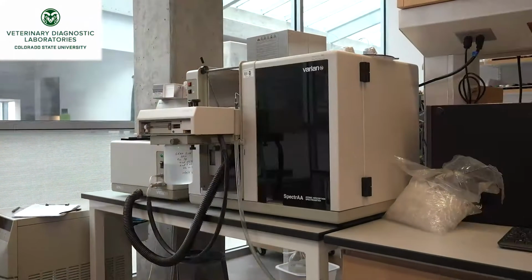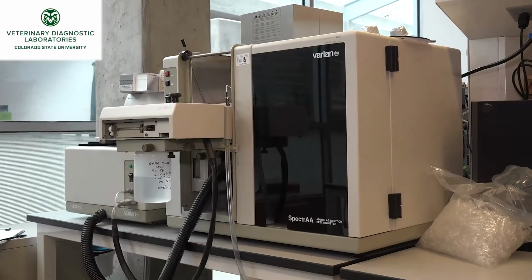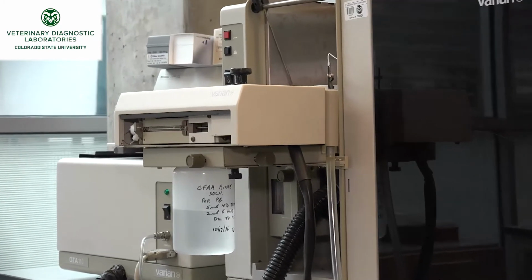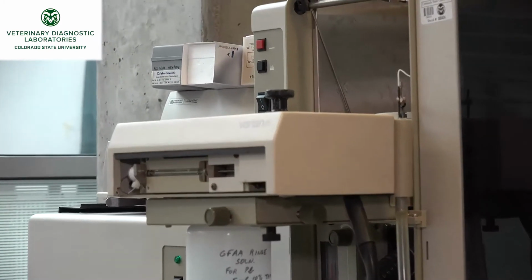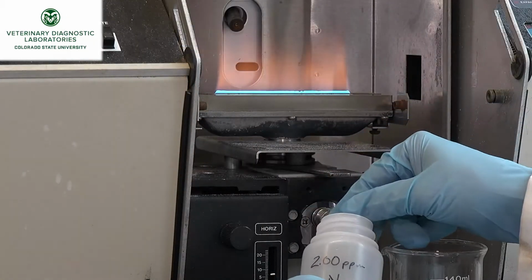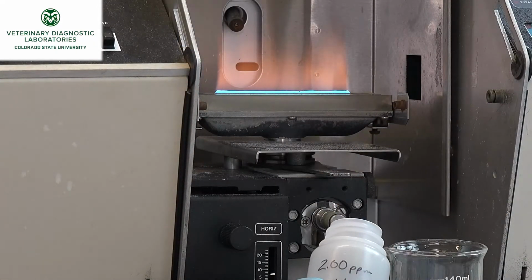We also do what is classified as some environmental samples, which means they're water or feed or something of that type. Then once the sample prep is all done, they're analyzed on one of the instruments, usually either HPLC, which stands for high performance liquid chromatography, or atomic absorption, which is what we do the metals on. On the mineral side, the one that we do the most of is copper.